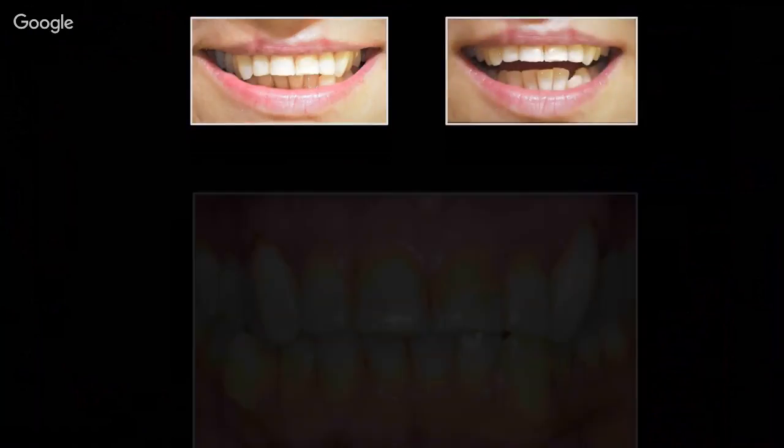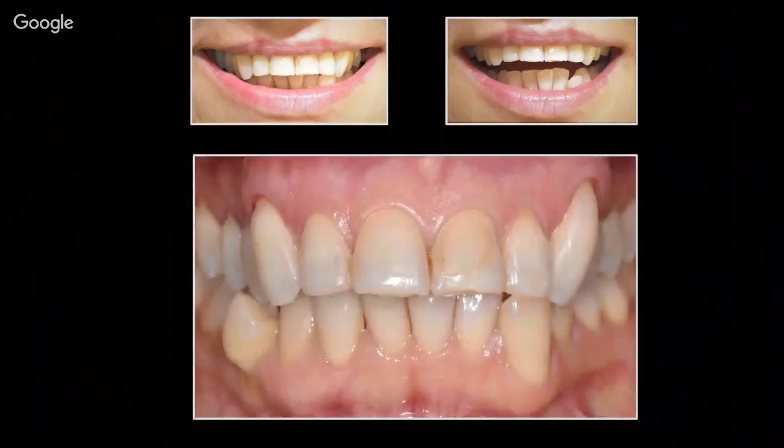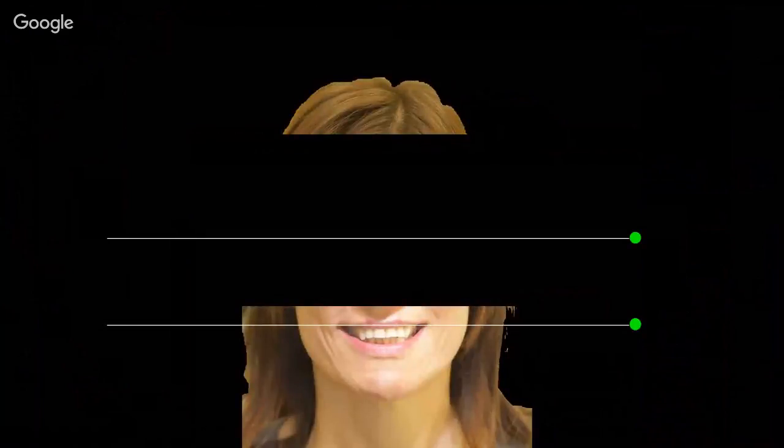Okay, anyway, she asked me to go for direct composite veneers, so even more tricky, but that's what we did. So I want to share this case with you. We can see some old bad restorations that we need to remove, but let's start with some smile analysis.